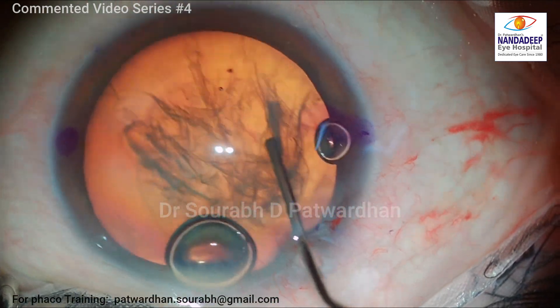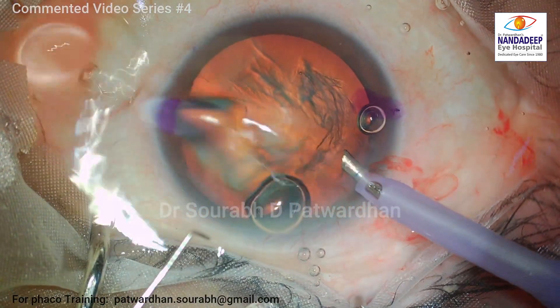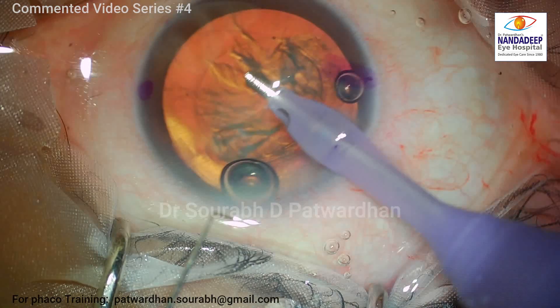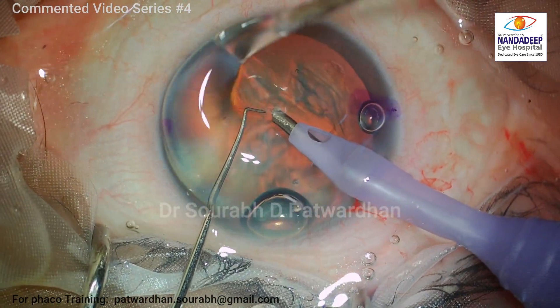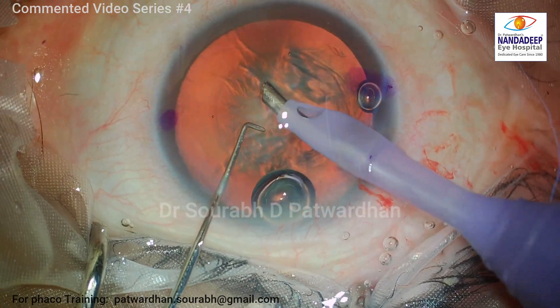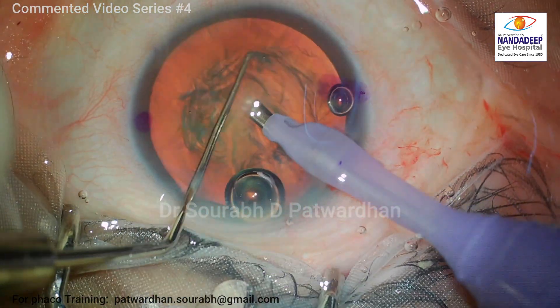Before doing hydrodissection, I just removed some viscoelastic from the anterior chamber so as not to have raised intralenticular pressure or back pressure. One of the common issues with high myopia, where there is a large anterior chamber depth, is that the anterior chamber becomes very deep when you start phaco.